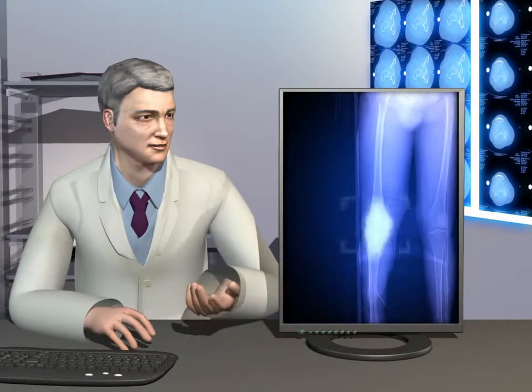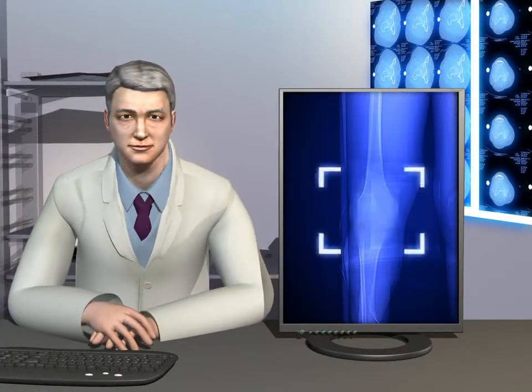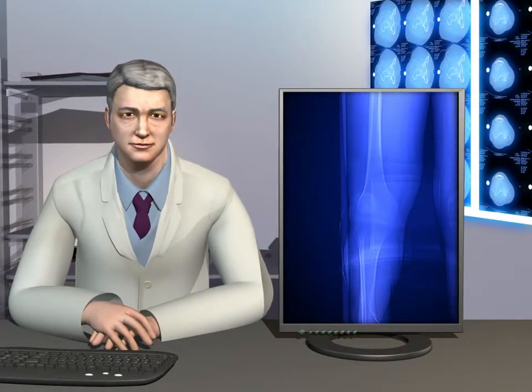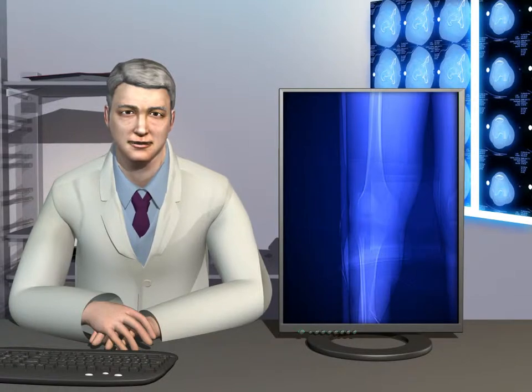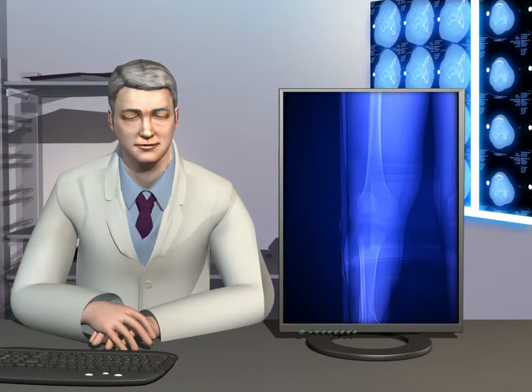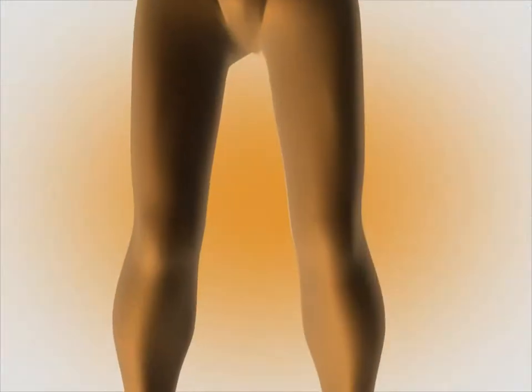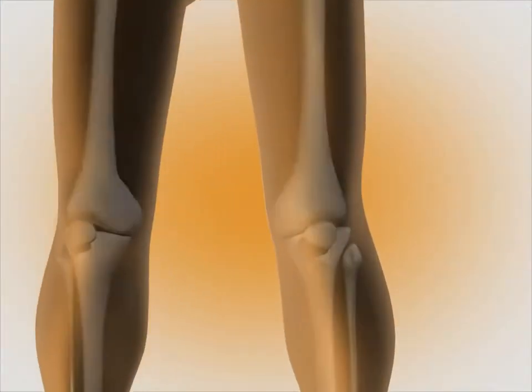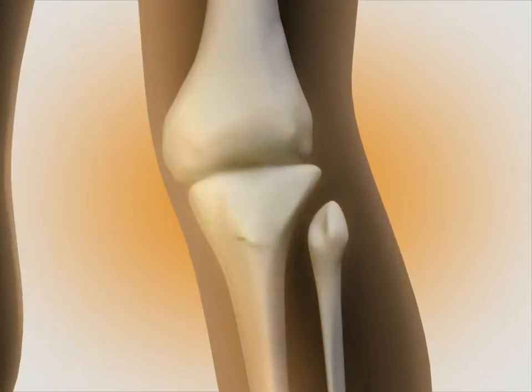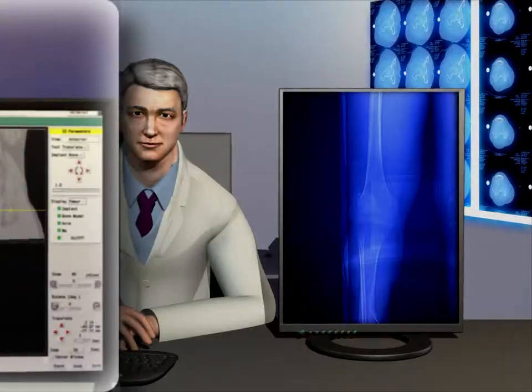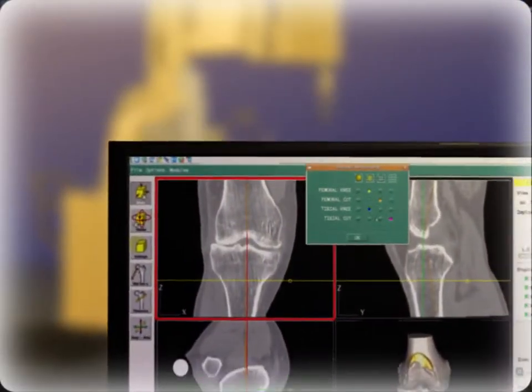According to the CT scan, his knee joint is diseased and no longer functioning correctly. We'll use the RoboDoc surgical assistance system to customize a plan for the patient and precisely implement the surgery.